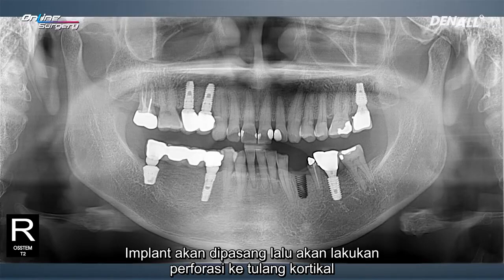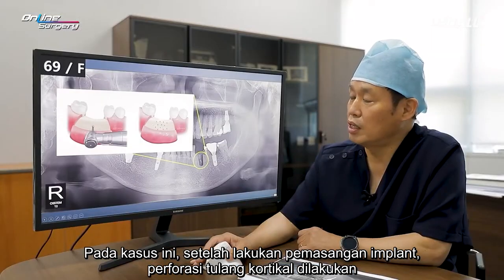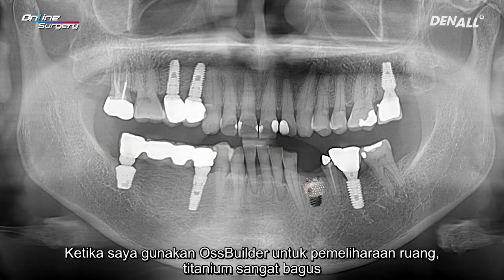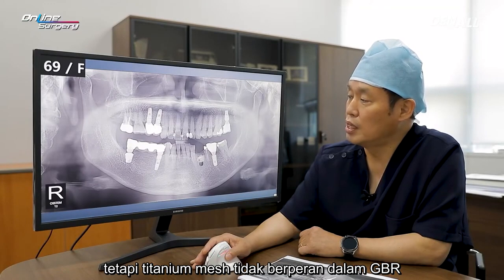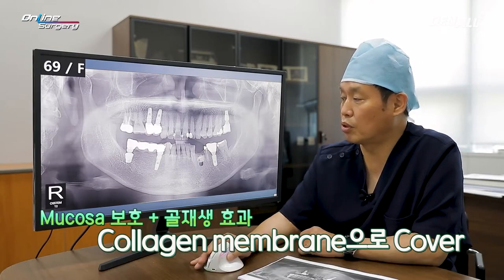Implant will be placed and cortical bone will be perforated. In my case, after the implant is placed, cortical bone perforation is conducted. After that, GBR is going to be done using OssBuilder. When I use OssBuilder for space maintenance, titanium is very good. However, the titanium mesh does not serve a role in GBR, so on the buccal side, to protect the mucosa and to get a better result, I use collagen membrane on top of it.